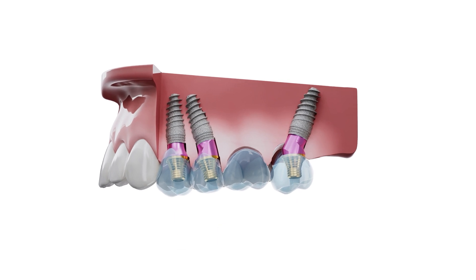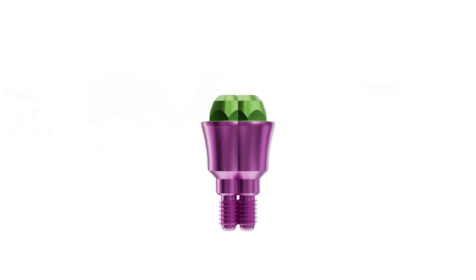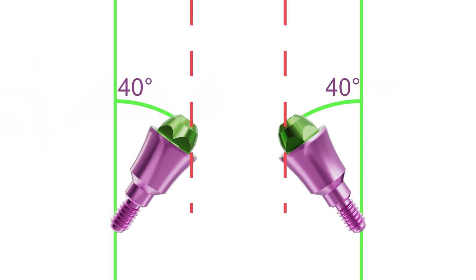Dentists are much more comfortable working with straight multi-units. With a classic D-type multi-unit with a large cone, you can see that at these angles the titanium bases will not seat all the way, but will rest against the cone of the multi-unit.